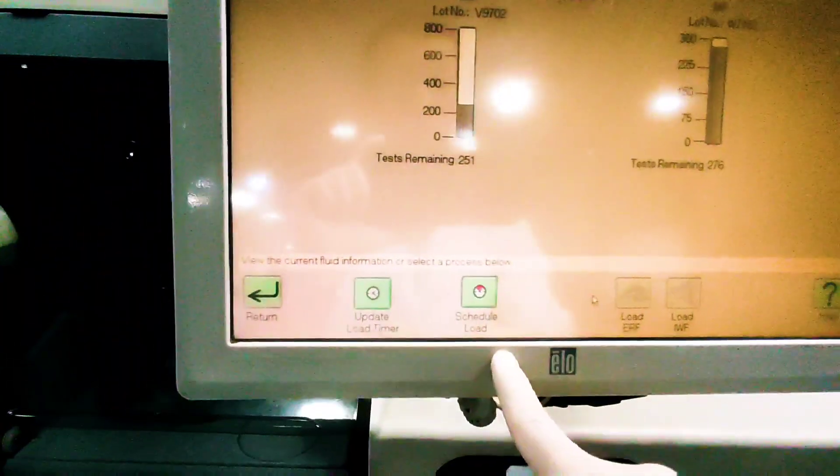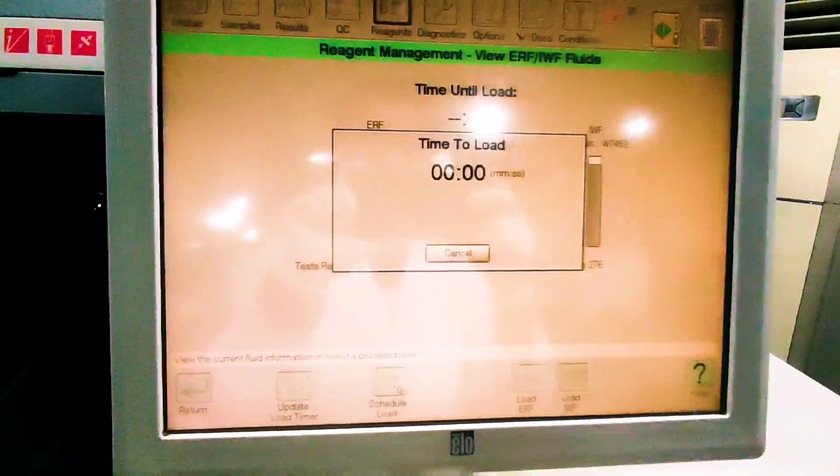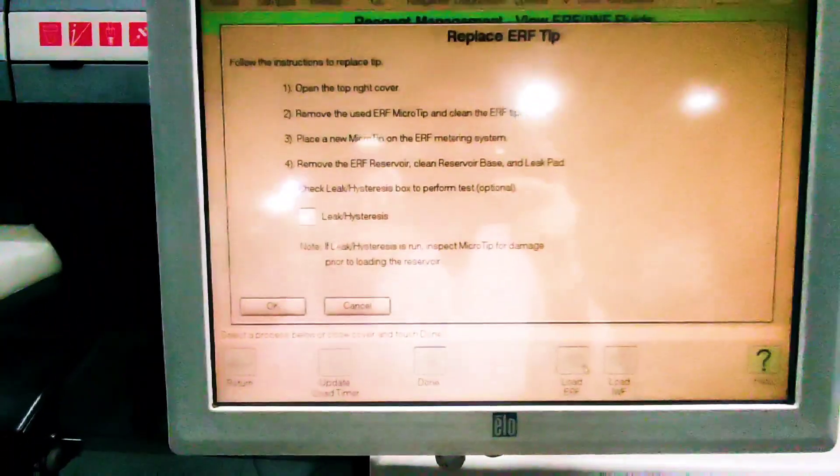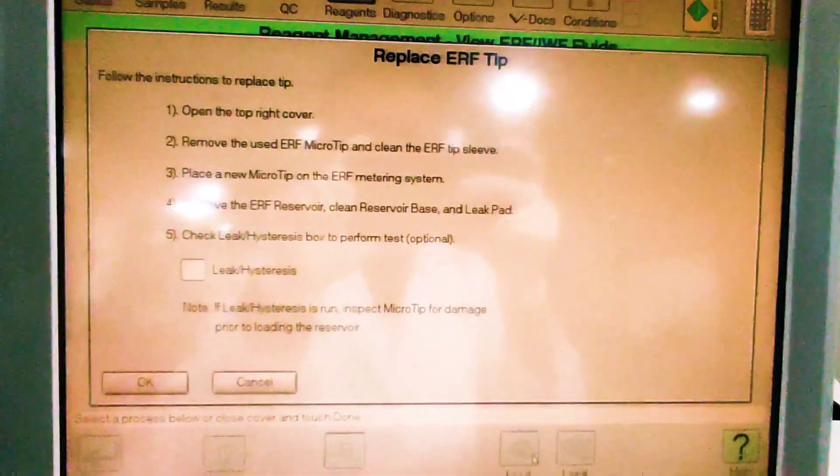so we better change it. Click on Schedule Load, and we click on Load ERF on the right side of the screen. Then the instruction window will open on the screen, displaying the procedures.